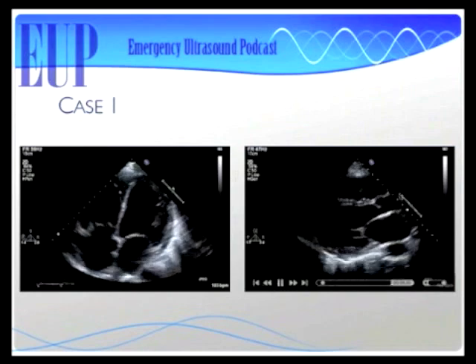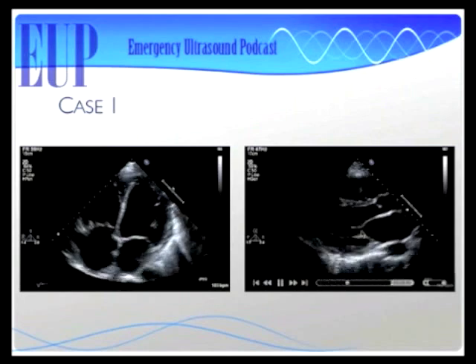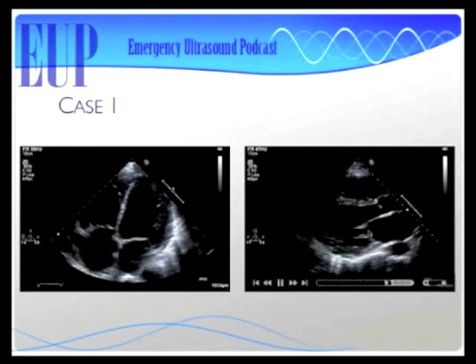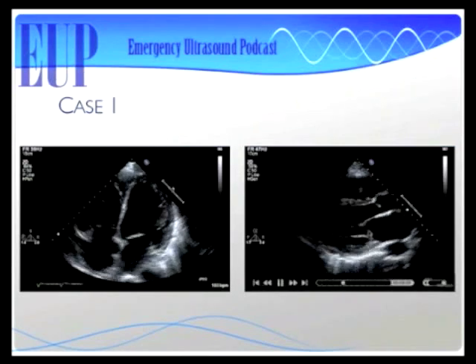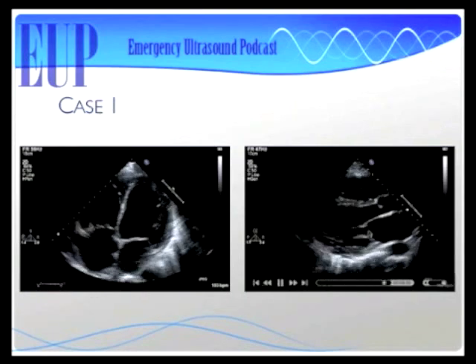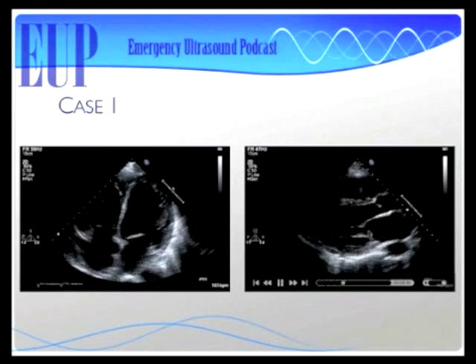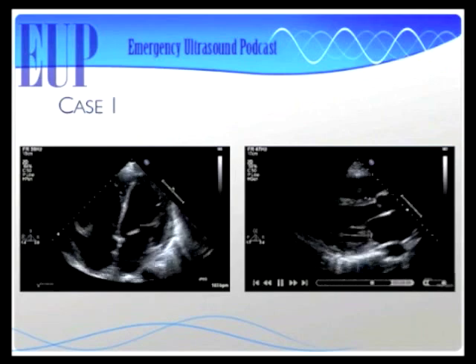And then if you look at the mitral valve, which is the valve right below the aortic valve, that anterior leaflet, the one on top, should be really coming up and almost touching that septum every time the left ventricle fills. And if it's not, then you know that your EF is pretty low. In fact, there was a study done where they looked at how close it should come to the septum. And in that study, they found that it should be within about 7 millimeters of that septum. And if it's not, then your EF is pretty accurately less than 30%. So that's something I sometimes teach some of the residents and other people whenever they're first learning echo. If you can't really get a grasp on how good the squeeze is just by looking at the LV, you can actually look at the opening of your mitral valve.